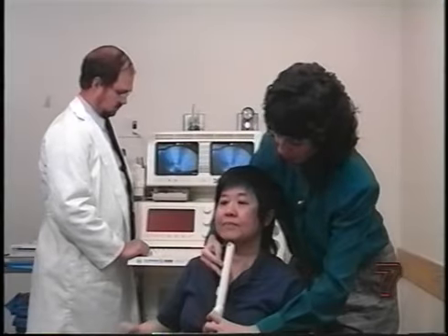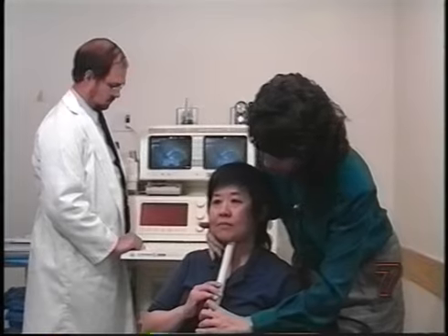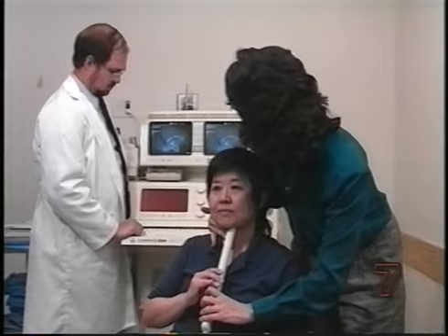Ultrasound allows us to see patterns and behaviors, even such simple behaviors as vowels and diphthongs.